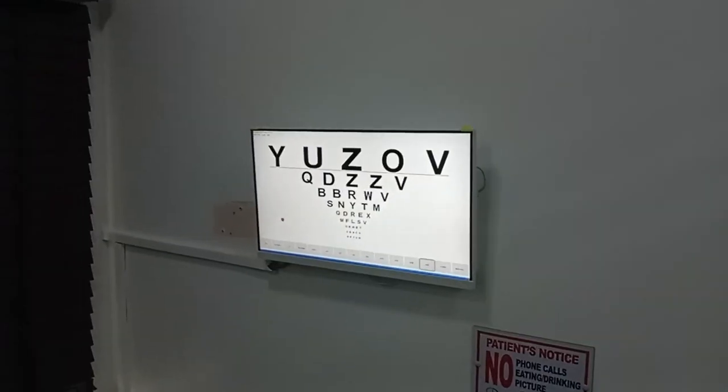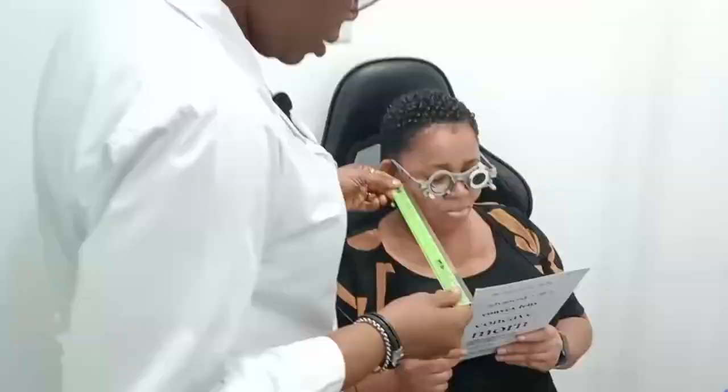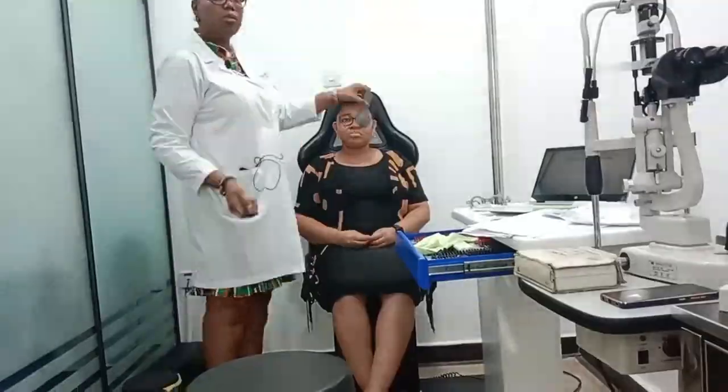Okay, so let's take it from the first line. I've closed your left eye, so you're reading with the right eye now. Fine. Eight.